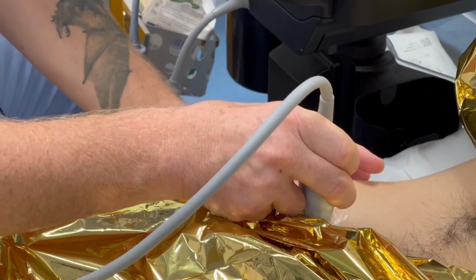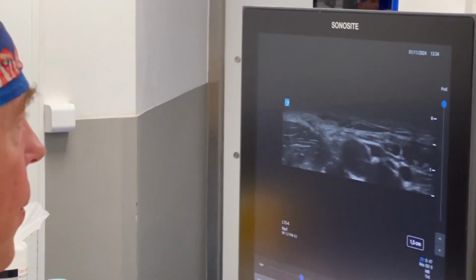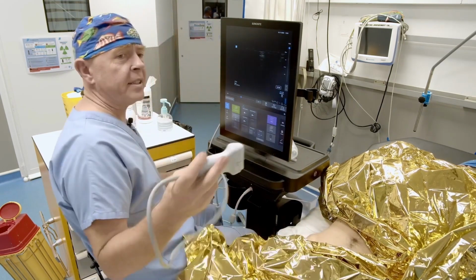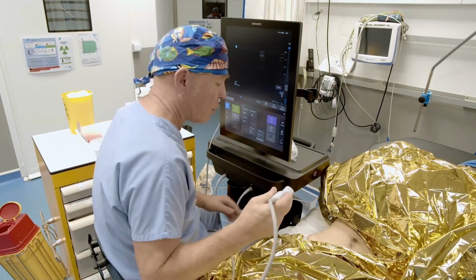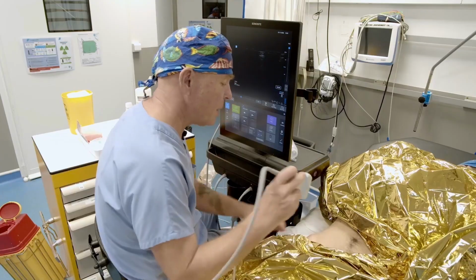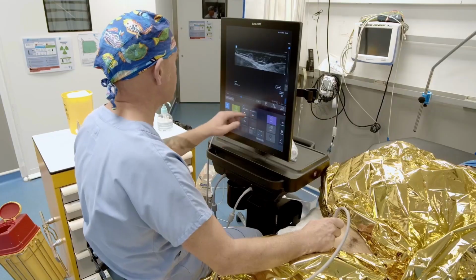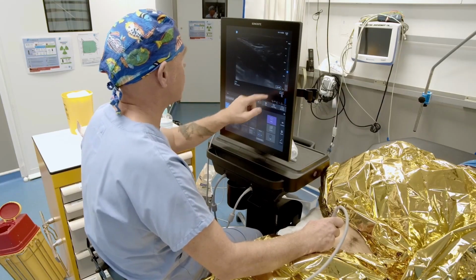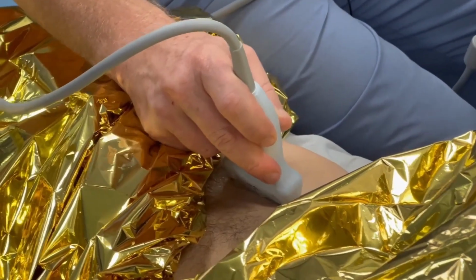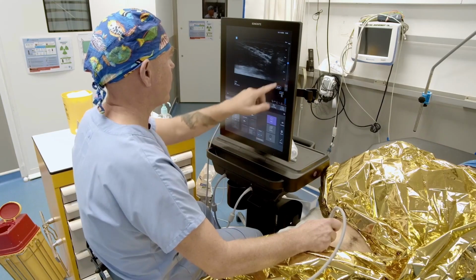My puncture point comes in from here, so my probe comes in from here, and my target is the femoral nerve. I'm taking advantage of this position to show you the iliac fascia block via the suprainguinal approach. Your main landmarks will be the anterior superior iliac spine, the pubic symphysis, and then at the outer third, it's often a little bit. So here I've passed. Oops, now I have too much. All right, there we go. And as you can clearly see, your landmarks are positioned right here. So this perfectly aligns with the anatomical diagram we discussed earlier.